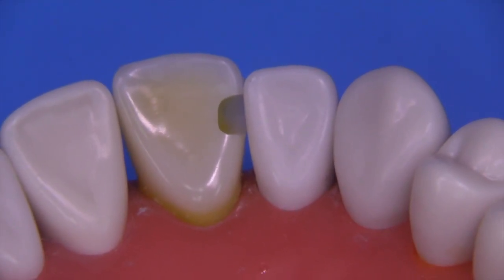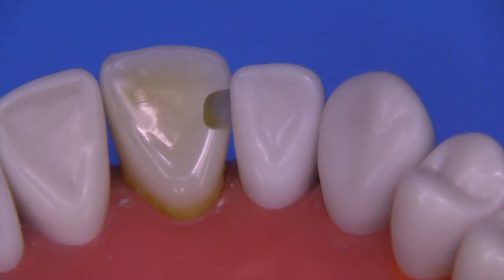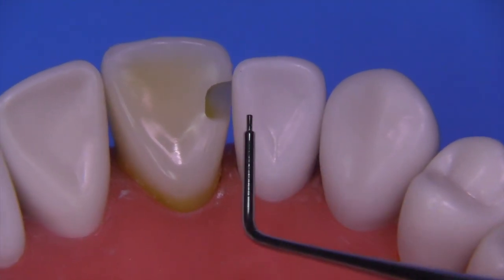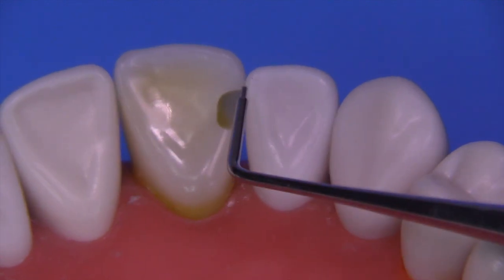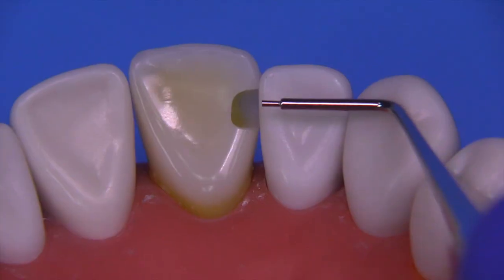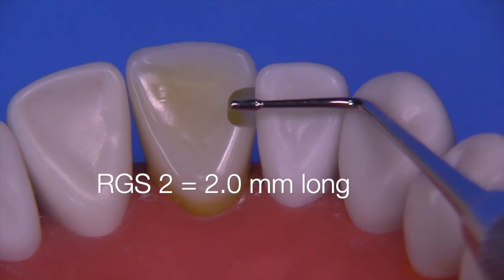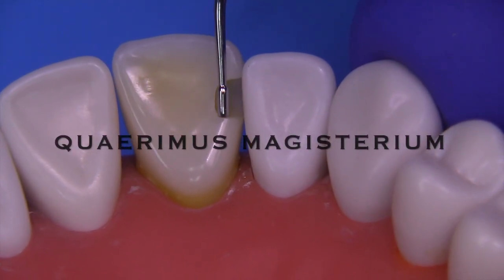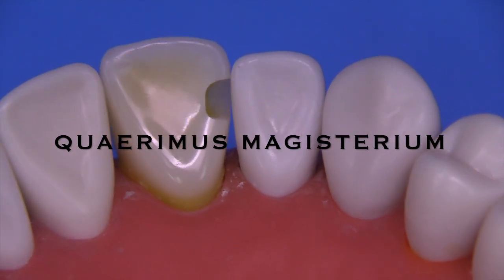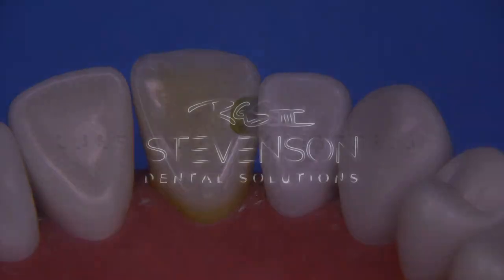No bevel is required anymore, so let's stay away from bevels — they make the preparation larger and harder to do. Using an RGS1 probe at 0.4 mm, we're about 0.3 mm broken contact on the gingival. The preparation is about 2 to 2.5 mm tall. I think this works out pretty well. Wishing you all the very best.